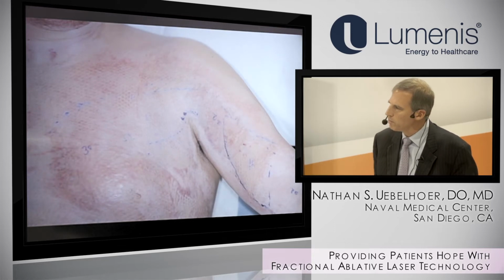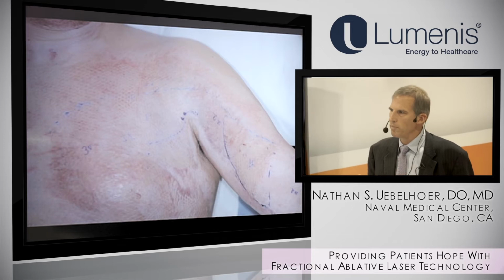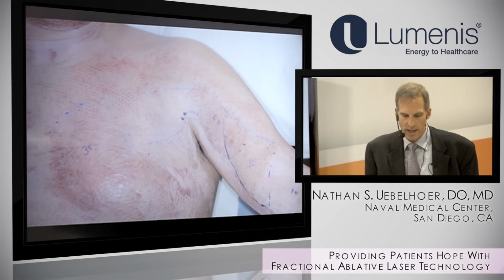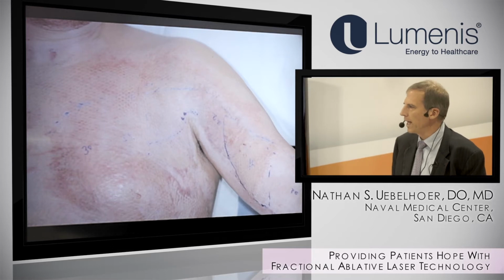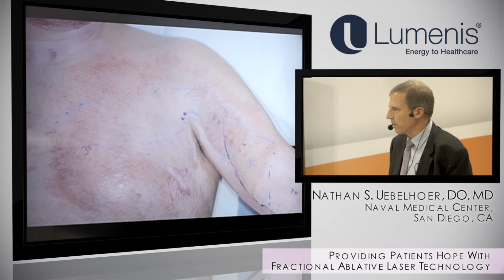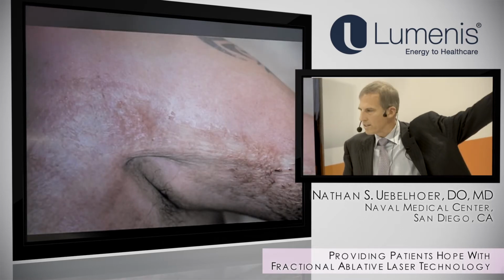I show this case too because this is a big arm. He's got a big burn across his body, down his arm, and we treated him early. You can see his tracheotomy scar is still fresh and red. And we went ahead and treated him with very, very conservative settings and immediately started to see improvements in his range of motion. You can see here he's trying to raise his arm.